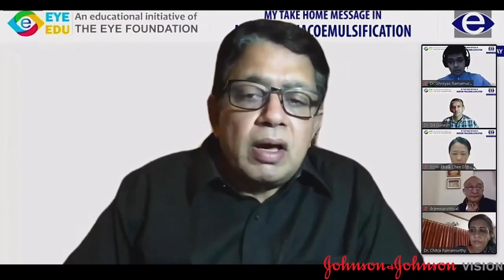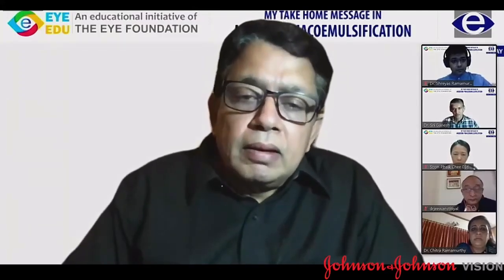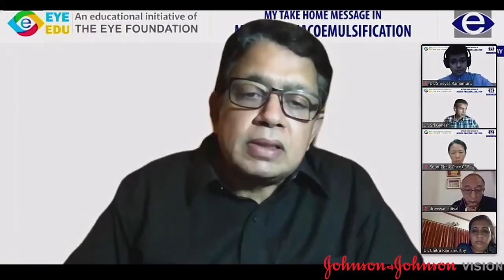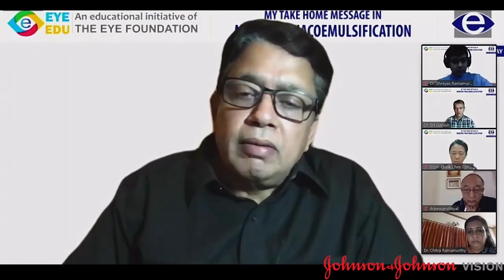So even in case you have a good immersion A scan, and you yourself or a trained biometrist is doing it consistently, you can get excellent results out of it, except for some outliers. And when it comes to using this data for arriving at the intraocular lens power, I think most of us would agree that the Barrett suite is a great way to go. And the good thing about it is it's available on the ASCRS, APACRS websites to all of us free of cost, even if you are not a member. So even in centers of ours where we do not have optical biometry, we have made it a point to use this, and I think our results of IOL power calculation have significantly tightened up.